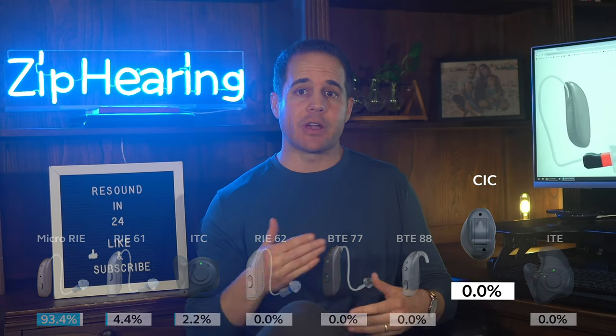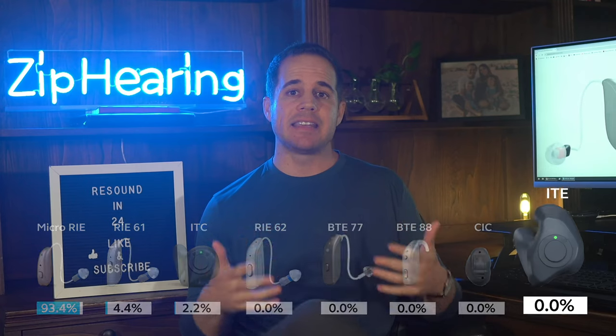Next up is the CIC, or Completely In Canal. We don't sell a whole lot of these from any brand — they're a bit of a hassle. You've got to change the battery every couple of days, they never have Bluetooth, and they're not as comfortable as receiver in-ear hearing aids. So generally, not a fan of this style of hearing aid.